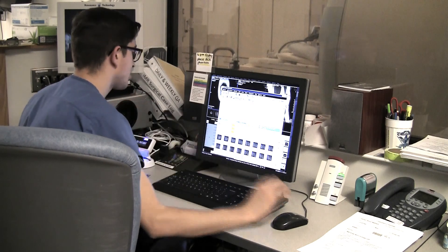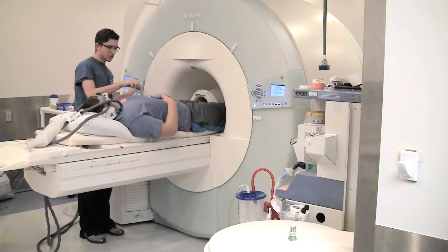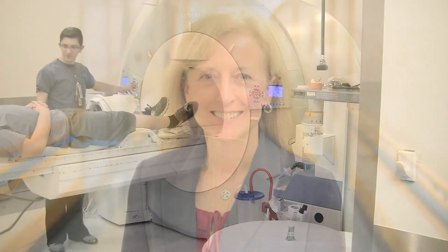All right, Brian, I'm just going to get these checked by the doctor real quick, but we should be all done. At the conclusion of the scan, the technologist will assist your child from the scan room. The doctor interpreting your child's MRI will provide a report to your child's doctor within 24 hours.